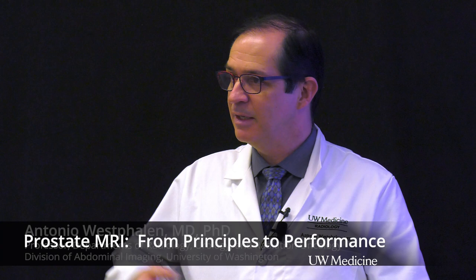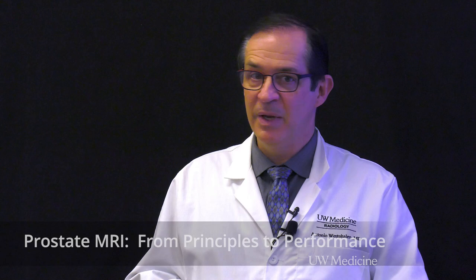The main issue right now is volume of data, in part because of the heterogeneity. It's so heterogeneous that to get something meaningful, you need to have not only the pathological heterogeneity, but the scanner heterogeneity, the protocol heterogeneity, the contrast heterogeneity. All of those things need to be considered. Now, patient age, patient ethnicity, and we don't have that. So it will take a while, I think. We have local small things that show promise, but I think that's where we are for quite a while still.